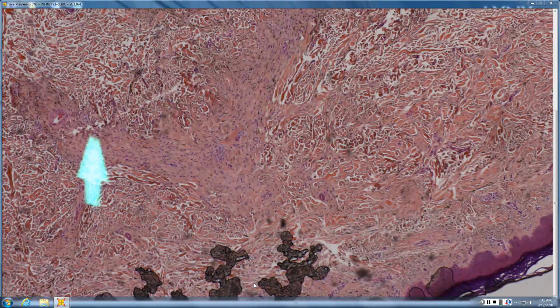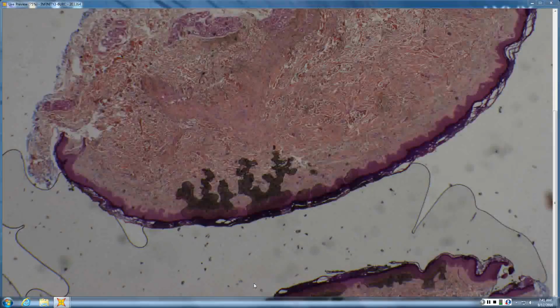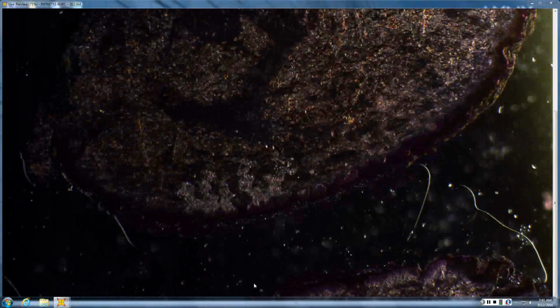One big branching. And then one trick that you might do is you might sort of go back to scan and kind of do your hand there. See how it blocks out? Yeah. So I would say this is some type of blue nevus. Yeah, exactly. So that just gives you a nice, by comparison, that's a blue nevus.